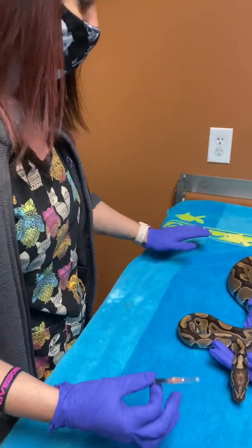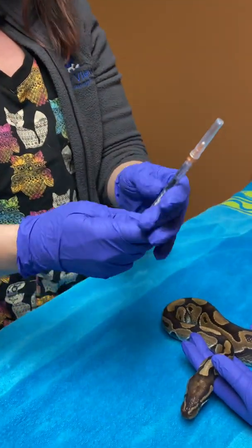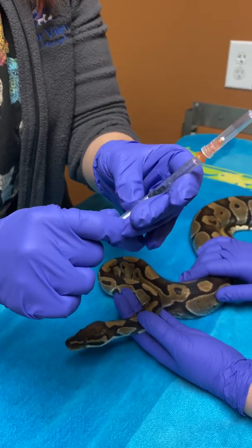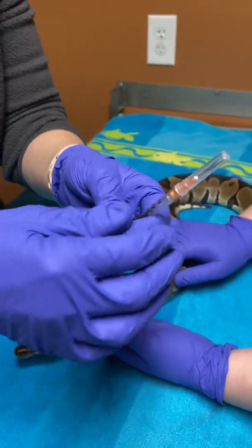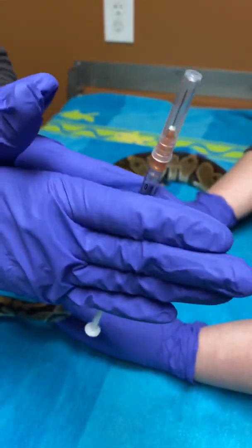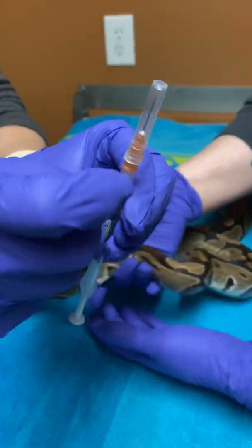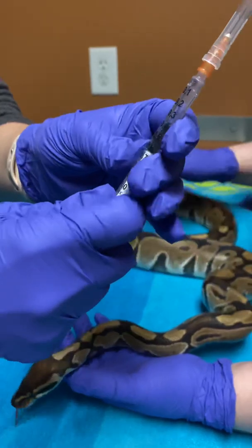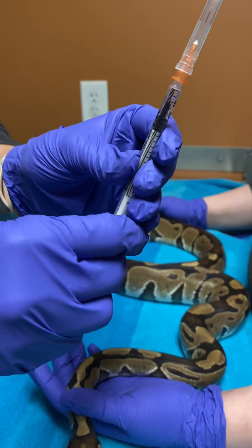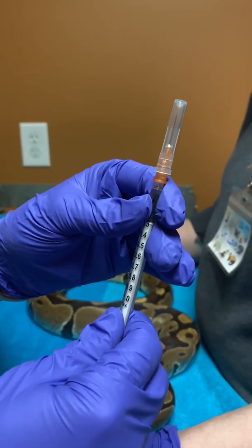Most of the injections are frozen, so when you take them out of the freezer, you want to make sure that you thaw them completely. The amount of medication in there is going to vary between different sized snakes. You want to make sure you're warming it up completely, with no ice crystals, and you can flick it to get rid of excessive bubbles, then move the medication all the way up to the top.